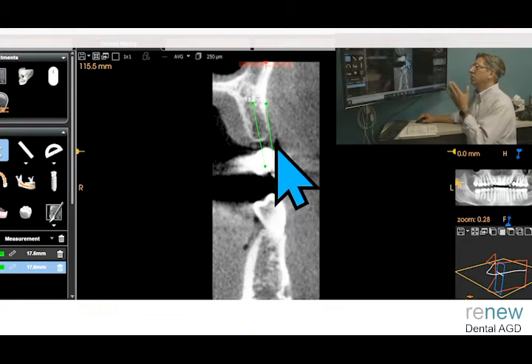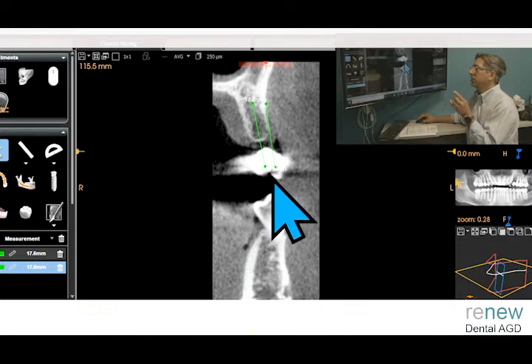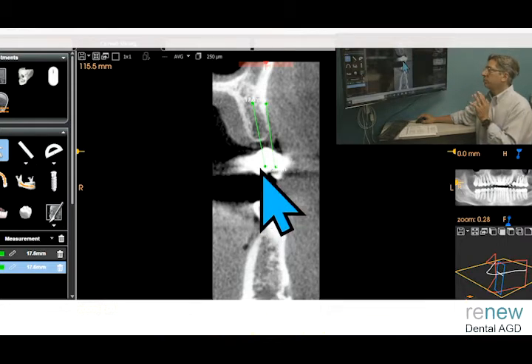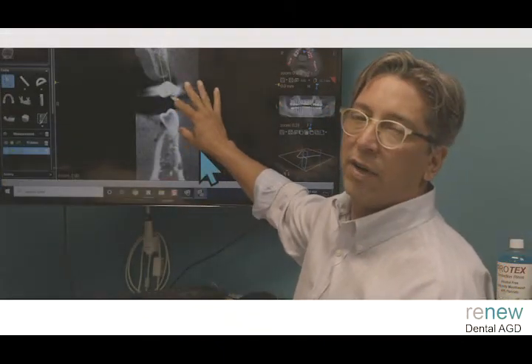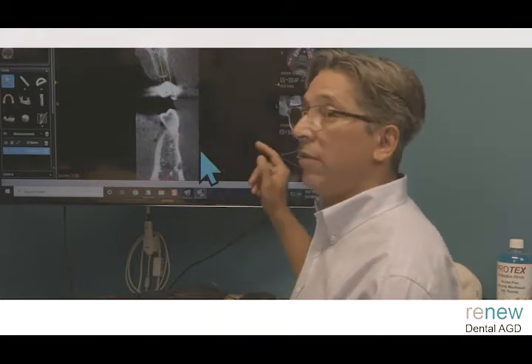I do these measurements so that I could actually see what kind of subtle angulation that I'm going to do for the initial drill. And then, of course, you can take your x-rays for the mesial distal direction, but you can actually assess this a little bit more clearly by having a perio probe, and you got the right angle. So this isn't a difficult case. I like first and second premolars for doctors' first cases, and so this is a very welcoming starter situation for two reasons: the sinus and for an initial placement of an implant. So that's what we have for this case.